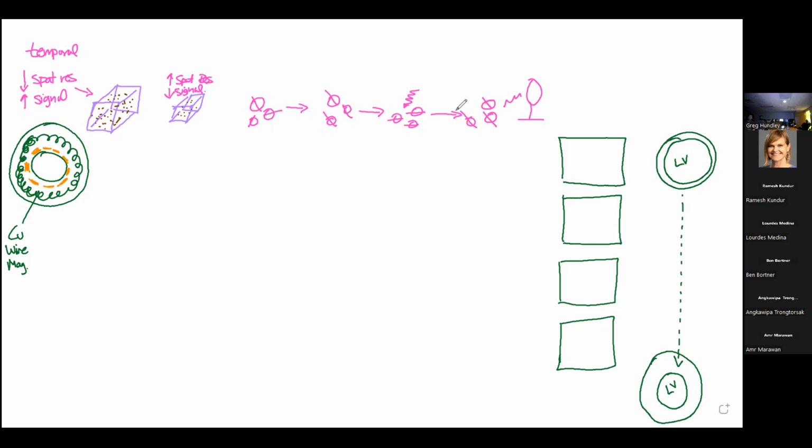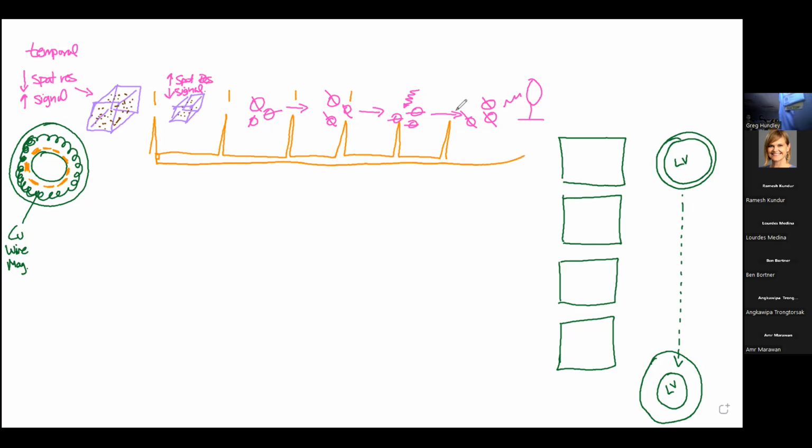So here, what I'm going to draw are some QRS complexes, and these are supposed to be regularly spaced. And the way we go about making the movie is we coordinate the picture taking with the EKG signal, so that with the first QRS complex, for this window of time in diastole, this piece of information comes over and populates this row of pixels on the first frame.